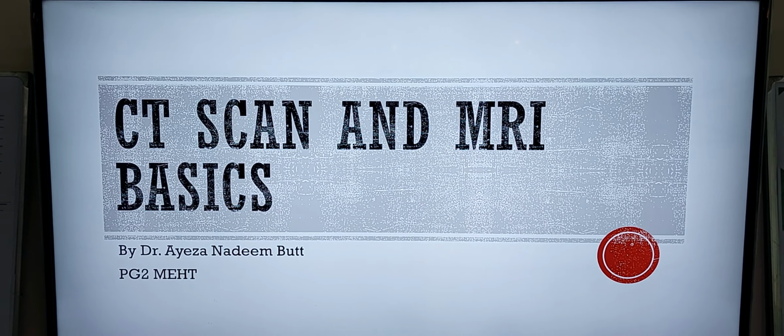Images are acquired in an axial form and can be viewed in any plane using computer reconstruction. The following figure shows three planes: the coronal plane, the axial plane, and the sagittal plane. This is the coronal plane, this is the axial plane, and this is the sagittal plane.